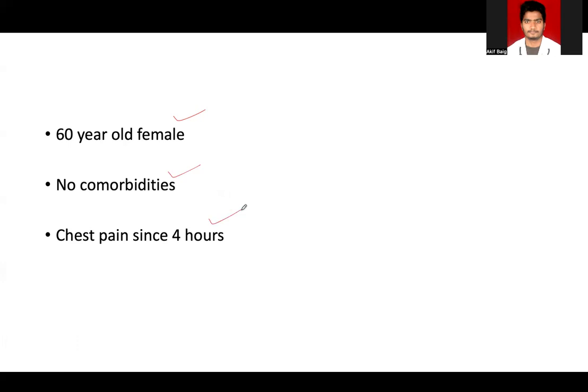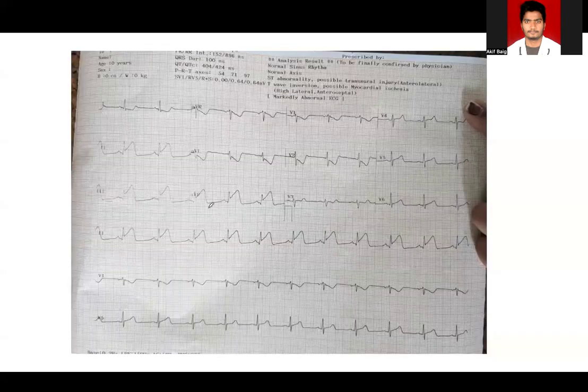What we do immediately when the patient presented is take an ECG. You can see this ECG here, it was a 12 lead standard ECG. Before going to any ECG, you should first know what a standard ECG is. So go from the basics all the time. The normal speed of the ECG should be 25 millimeters per second.